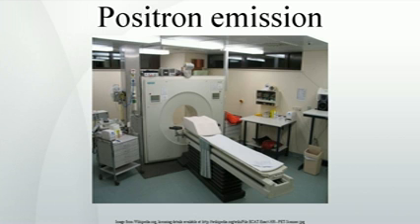This is very useful in showing detailed views of moving organs or structures with higher anatomical variation, which is more common outside the brain. At the Jülich Institute of Neurosciences and Biophysics, the world's largest PET MRI device began operation in April 2009, a 9.4 Tesla magnetic resonance tomograph, MRT, combined with a positron emission tomograph, PET. Presently, only the head and brain can be imaged at these higher magnetic field strengths.